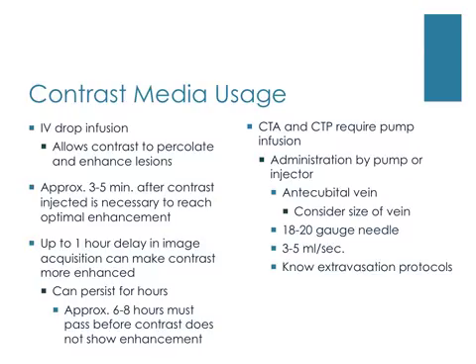A CTA and CTP require the opposite contrast method, which is the bolus infusion. Images are required during rapid contrast administration by a pump. So that is basically what a pump infusion is: rapid contrast administration, as compared to the drip, which is a slower contrast administration. You'll often see or hear techs using an injector for administering their contrast, that is using the bolus method. For the CTA and CTP, the bolus method opacifies the cerebral blood vessels.